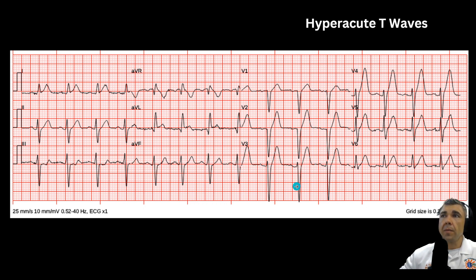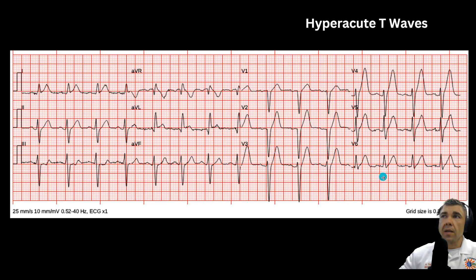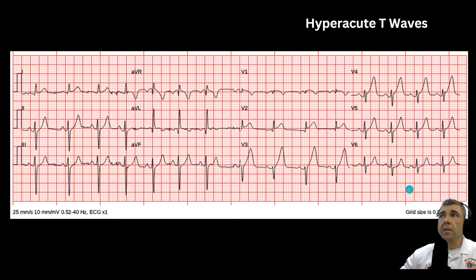Here's another example of hyperacute T-waves. Again, these are broad-based, tall, and very symmetrical. It's common to see these in the anteroseptal leads and the anterior leads as a whole, all the way to the lateral wall. You can also see them sometimes in the inferior leads if the patient is having an inferior wall MI. This pattern reinforces the anteroseptal wall MI — LAD occlusion patient. Remember, these are the ones that die fast, so you want to be ready to treat these patients.